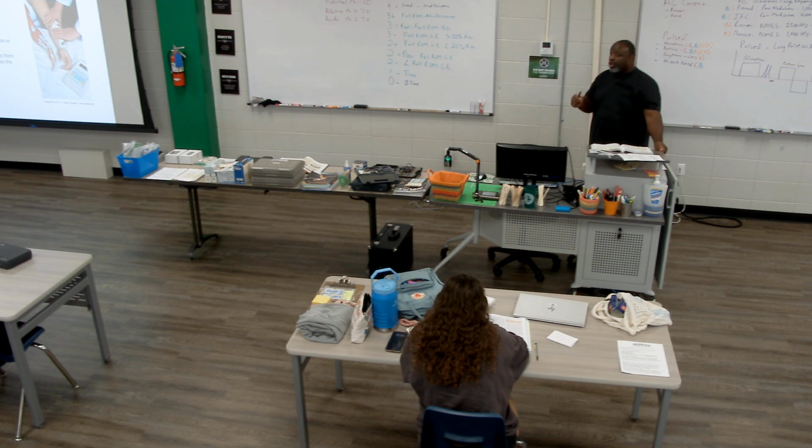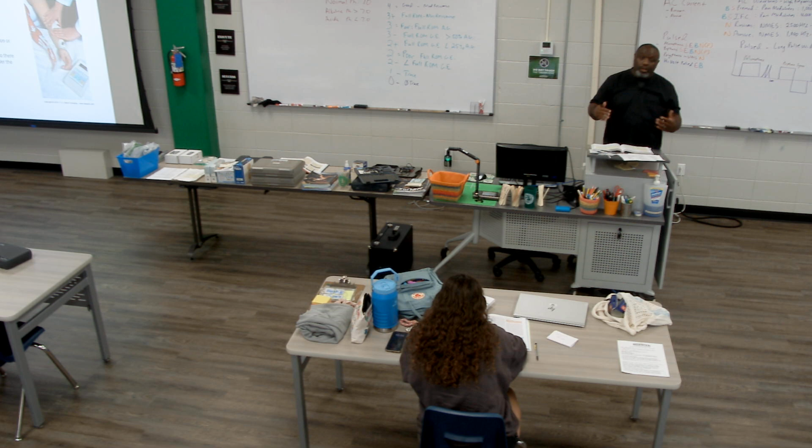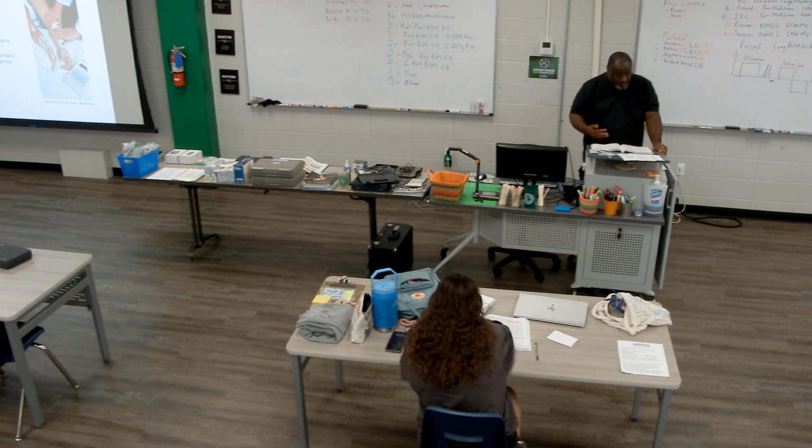So using current allows these pathways to open and let medication be delivered into the skin, but at some point that pathway will close. You don't want your pathways open and letting things into your skin. Germs or a lot of other stuff can get in and can cause your body damage. So it's time dependent. The time required depends upon the duration of the current applied and the current density.